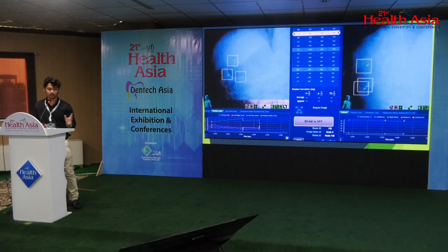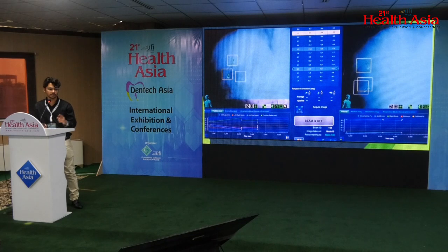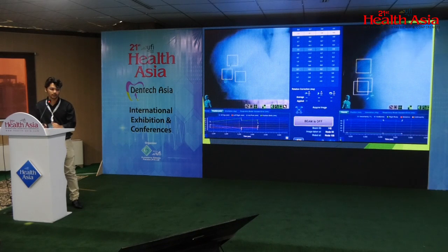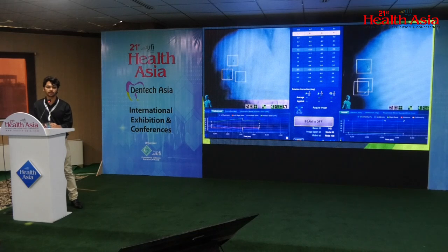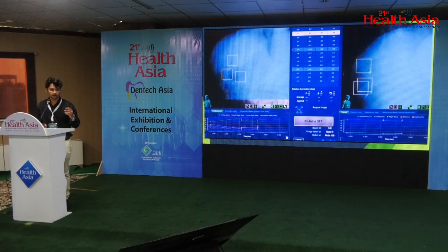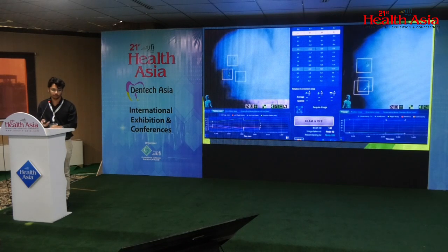Now this is a treatment of a patient that was being treated for hepatocellular carcinoma at Cyberknife JPMC. You can see this is not actually a video, but a series of X-rays taken simultaneously, so we can study how the tumor is behaving. If you notice, we cannot actually see the tumor, but we can see the gold markers. So these gold markers serve as a reference at whatever axis the tumor is moving. And these images serve as a complete respiration cycle for the patient.